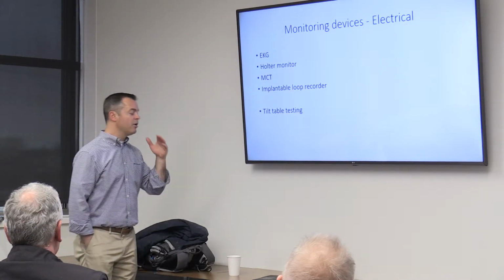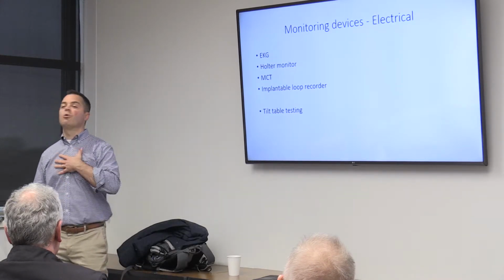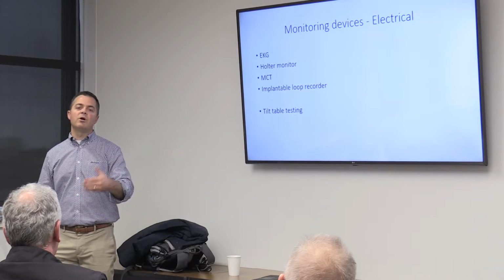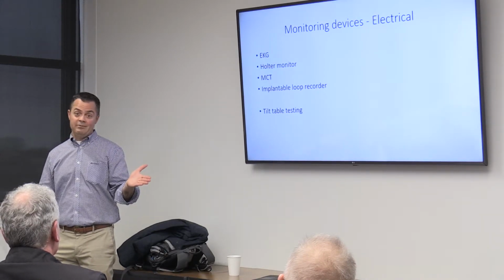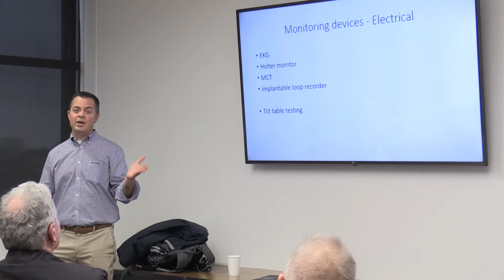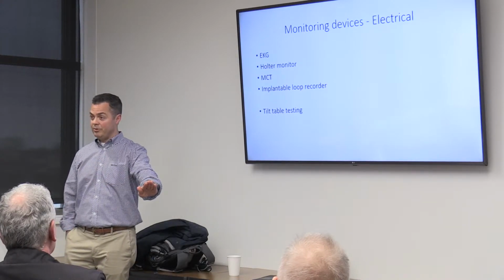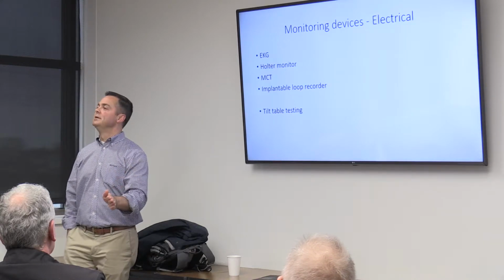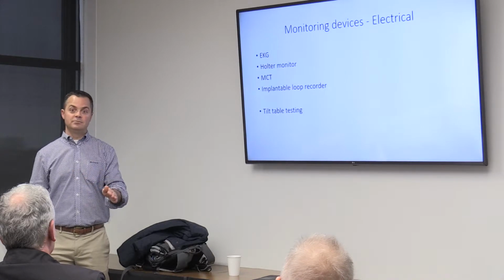What we have today are a couple things. We have what's called a Holter monitor, which has been around for a long time. And this will record every beat of your heart for 48 hours, okay? So I can give it to you, and you can wear it for a day or 2 days, but that's it. So it's helpful if you're having symptoms every day. But if it only happens once a month, I guarantee you I'm going to give you a Holter, and you're going to feel great when you're wearing the Holter. And then when you bring it back, like, damn, it came right back. We're going to struggle.